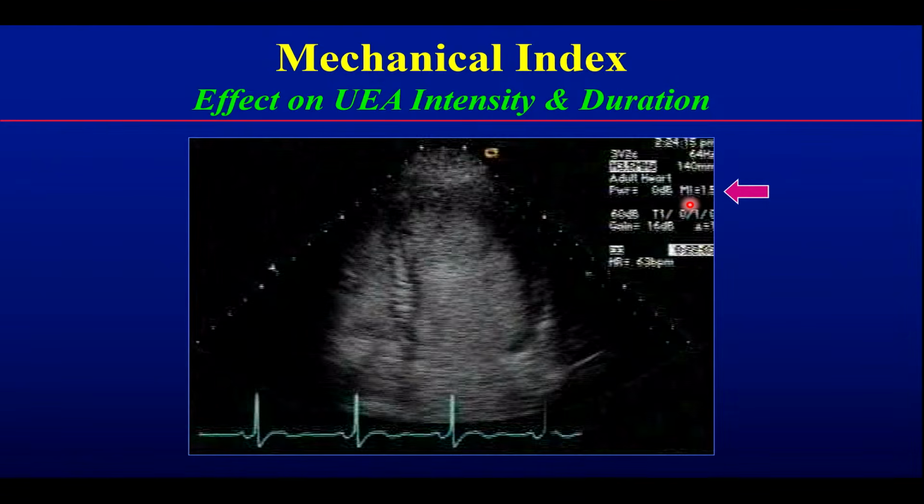So what we're going to do here, this is MI is 1.5, which now I'm going to play it and you will see what happens. It almost looks like a hurricane, meaning quite a bit of the contrast that came in is being destroyed, and that's why you start seeing hurricane. You know you're not overdoing it because you don't have the shadow behind it, right? So you could say maybe I have very little contrast, but actually you have very little contrast because you are destroying it, okay?